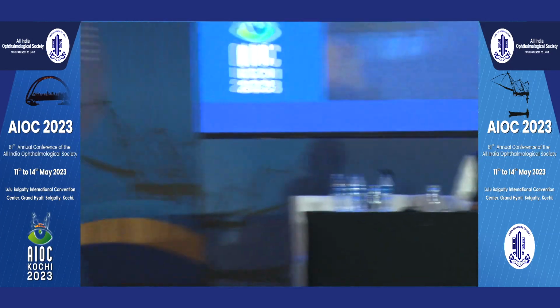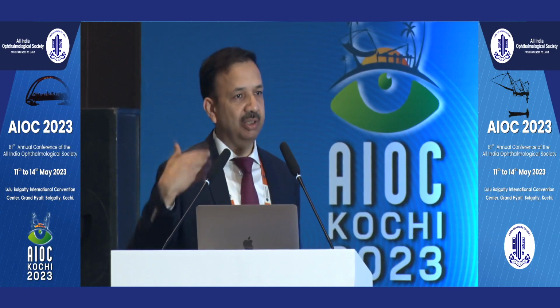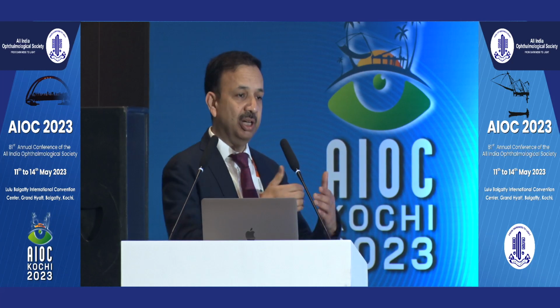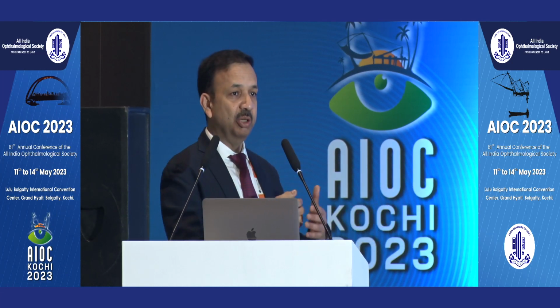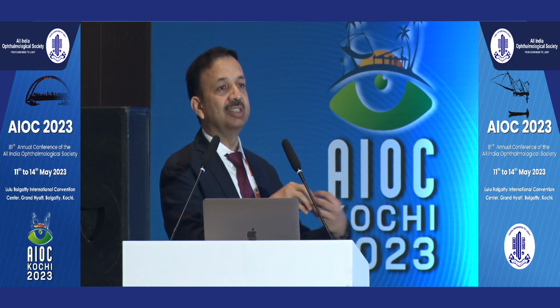That is my explanation. Ideally, when we train people and they want to start, we tell them to do a temporal incision, because you don't have the brow or something which affects, and you have a much better working area. And as you rightly pointed out, the diameter is slightly wider. So when you put in your graft, you don't have the problem of the graft being partially stuck in your cannula and not going out.